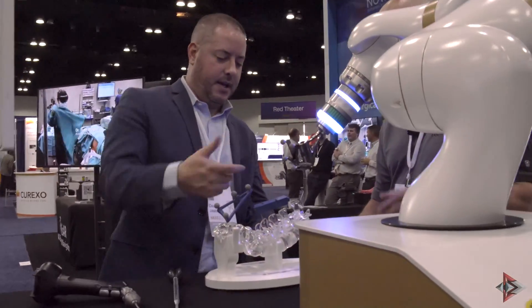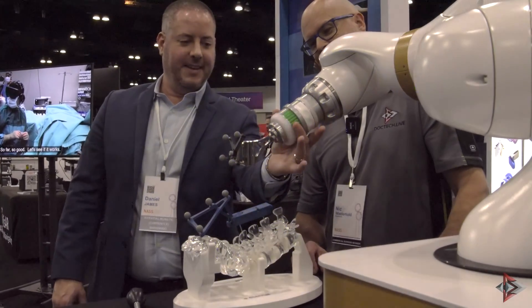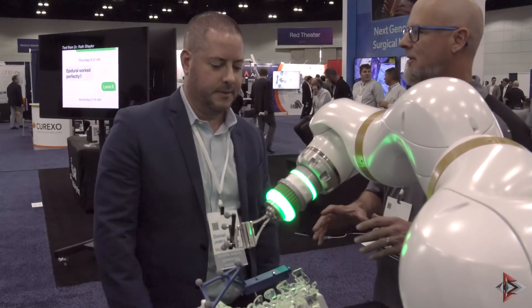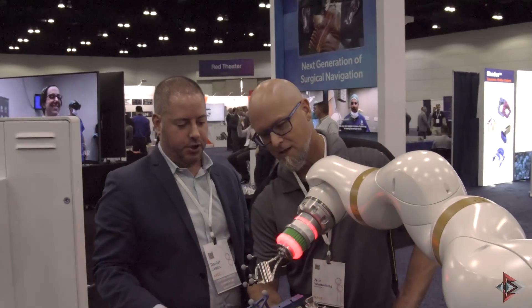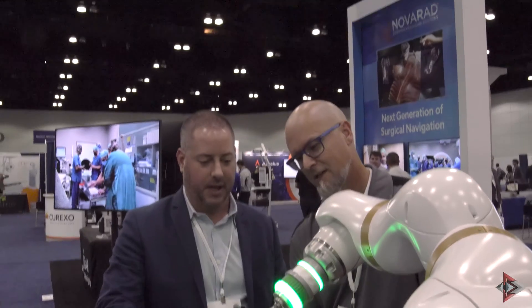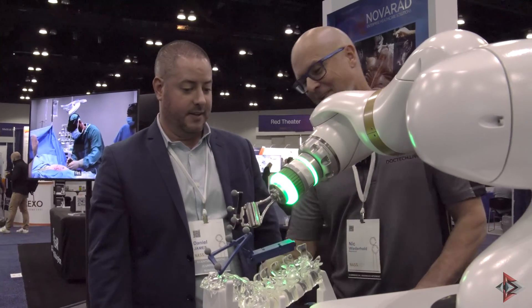The green button does the fine-tune movements — you already know how to use it. From anywhere you are, I'm not moving it myself, I'm just pressing these buttons. The robot's putting itself where it wants to be — it's a collaborative robot. You can either control it yourself or let it go autonomously. When it's red, it means it's either adjusting or not where it's supposed to be. When it's back on green, you're good. You don't want to move too fast, but it's still tracking.